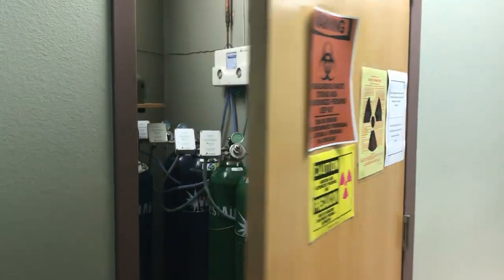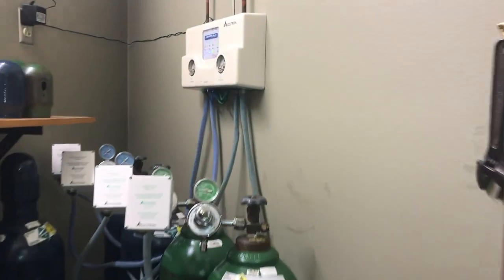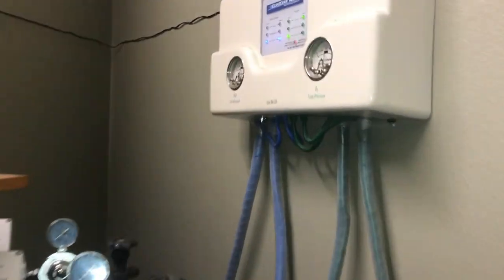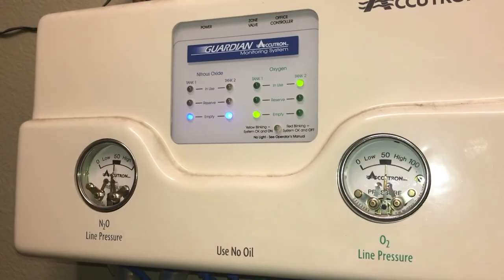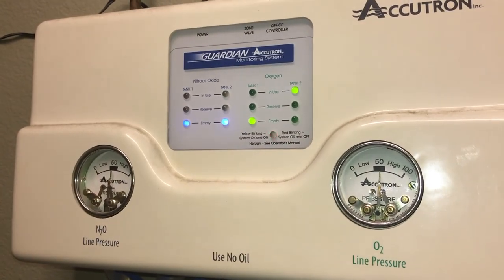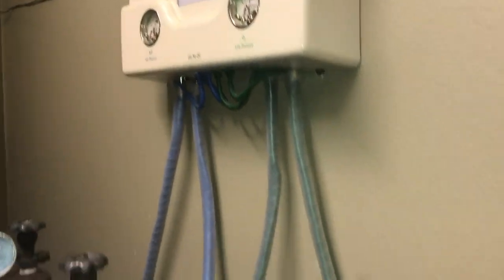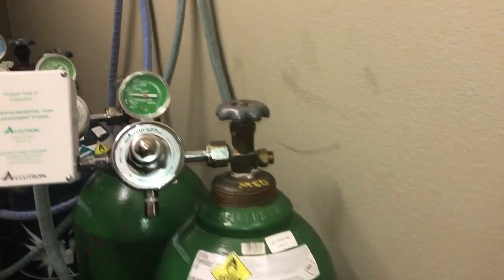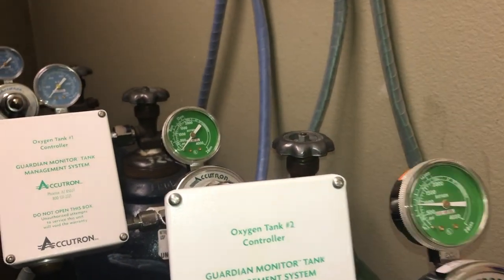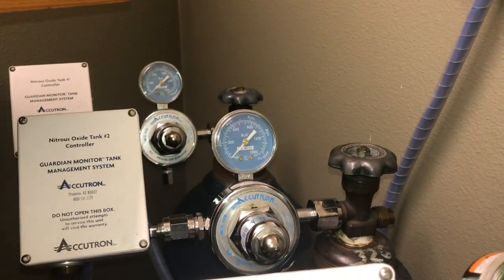The first process demonstrated in this video is when faculty are preparing the tanks and turning the central system on for student administration at the beginning of clinic. You'll notice the red blinking light indicating the system is OK but off. The first two tanks are oxygen and they are in green. The second two tanks are nitrous oxide and they are in blue.